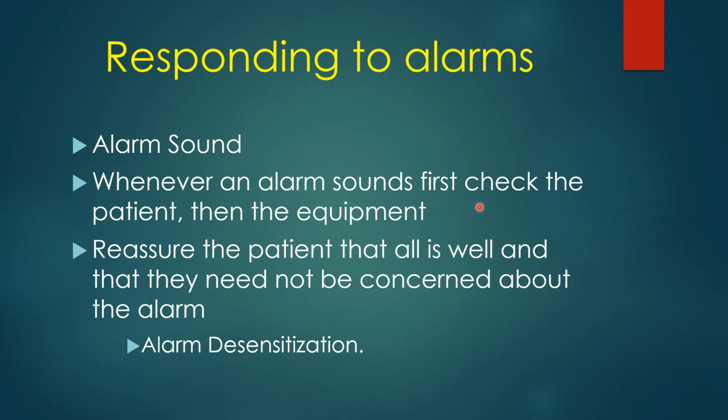Another instance that happened around that same time was a patient who was setting off the alarms on his ventilator continuously, and they had him tied down, and they were saying the patient was bucking the vent. He's fighting the ventilator. And so I went in and did my check to see what the problem was and if there's anything that could be done.